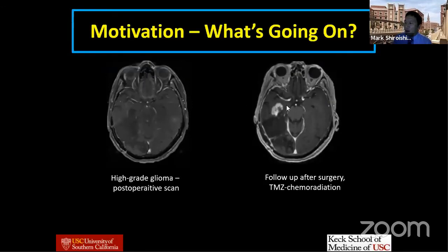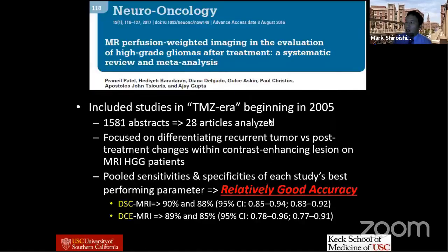This is conventional MRI. Whereas with perfusion MRI, you're imaging before you inject the contrast dye, while the contrast dye is being injected into your arm, and after it has been injected, you keep imaging for a couple of minutes to see what the perfusion or blood volume measurements are in that lesion.